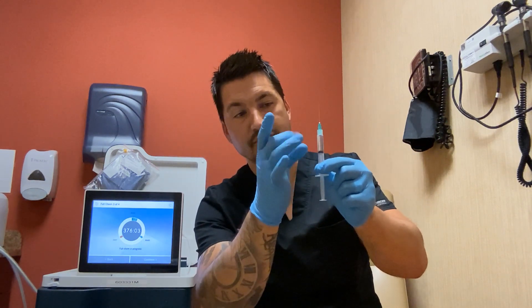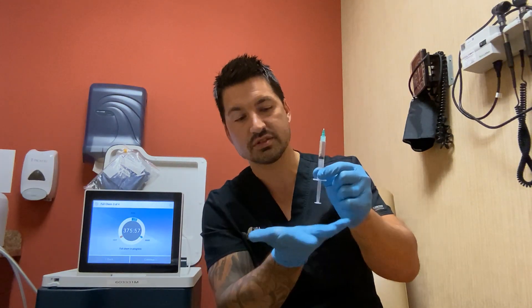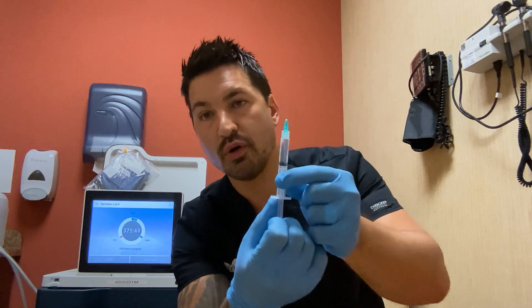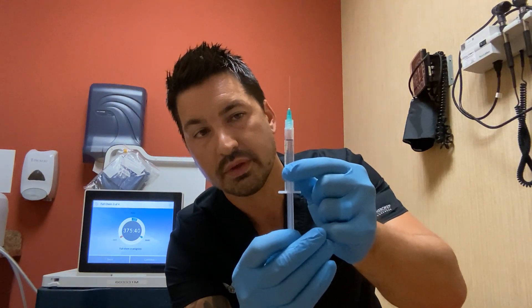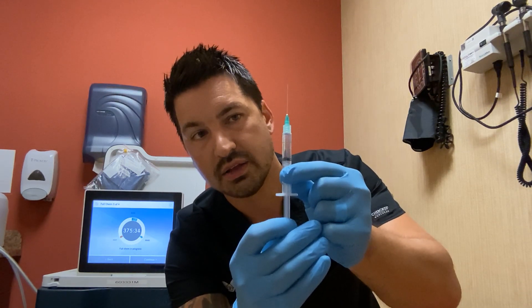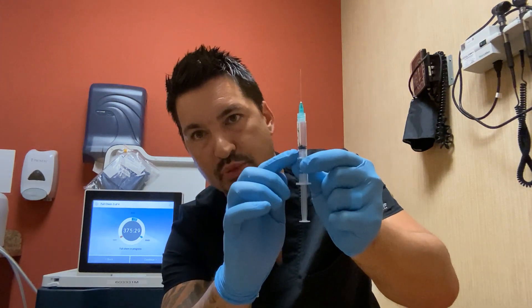If you have some air bubbles in here, you can take your finger and flick them out. Keep in mind, you don't want to push on the plunger because you're going to lose medication out the tip. If you have a larger air bubble that's not coming out, feel free to pull back on the plunger — you'll see the air pocket created there. Keeping the syringe completely level, you can force that air bubble out by pushing the plunger very gently and slowly upward, and now that air bubble is completely out. I'm still at my 1.6 ml order for my hep lock.